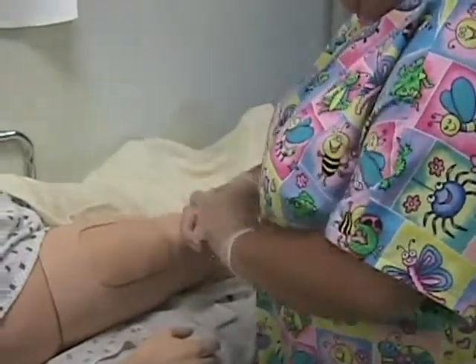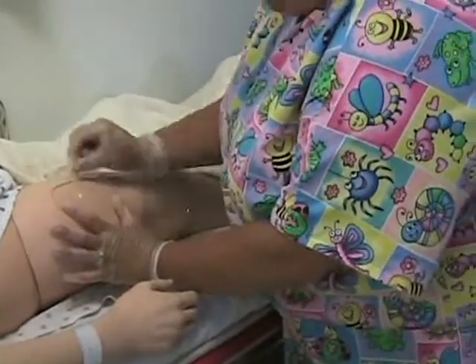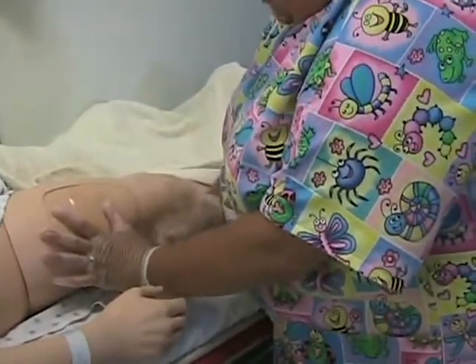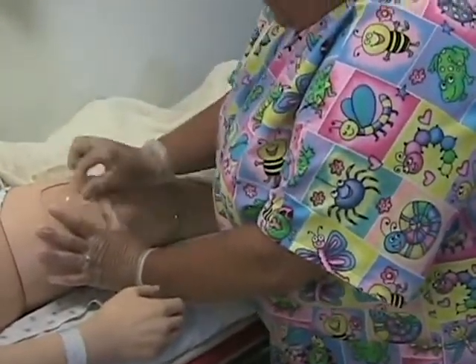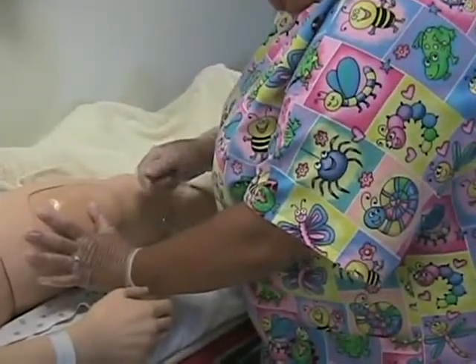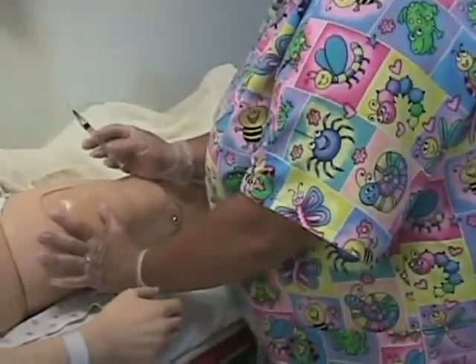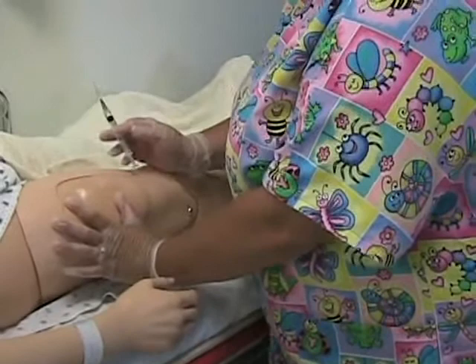So what we will do then, keep an eye on the site. We'll go ahead and stabilize our muscle. We're going to wipe once, or you can also go out and around, in one easy quick swipe. We're going to go ahead and let it dry. Popping off our cap, waiting for it to dry. On the mannequins, it takes a little bit longer.